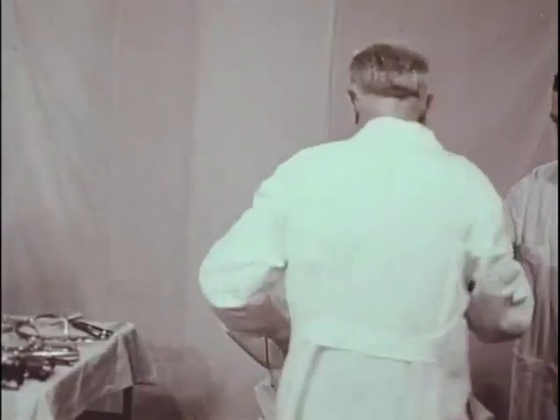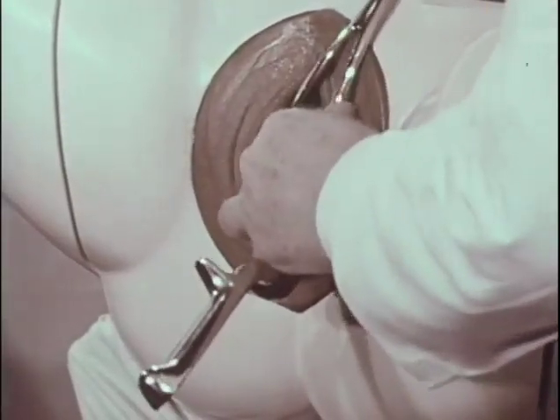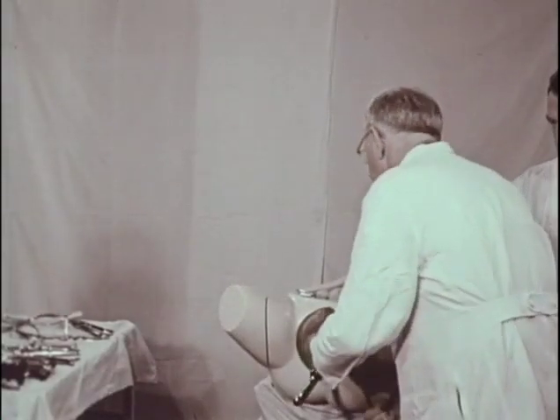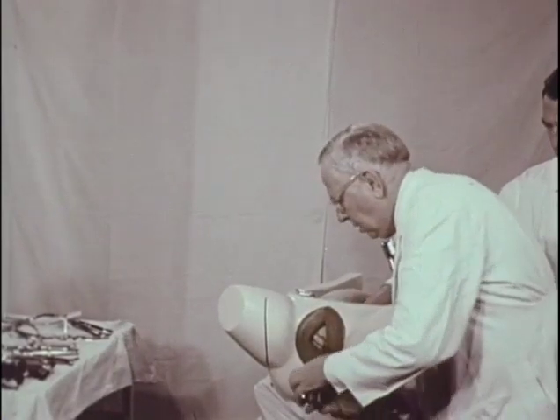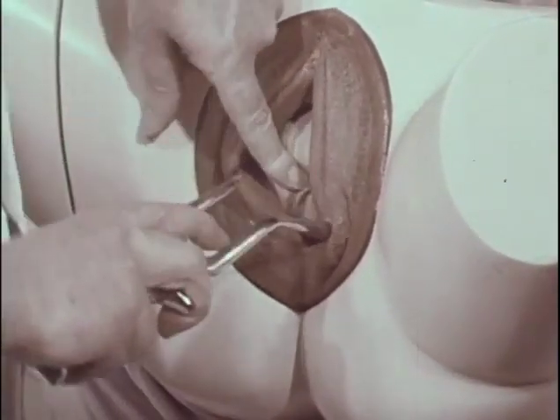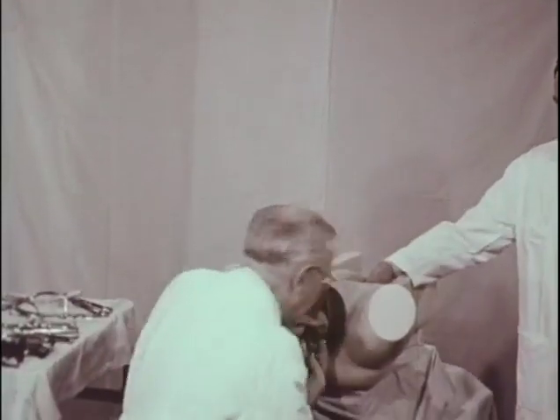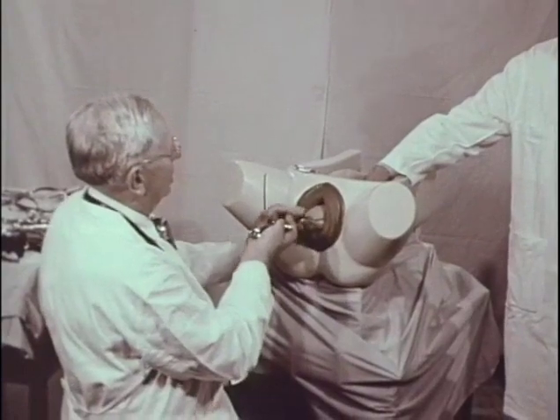And now the anterior blade, inserted in a similar manner to the right side. Locking. Checking the application, completing the rotation if necessary to OA, sit down, proceed with traction.